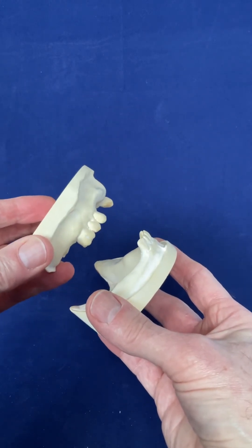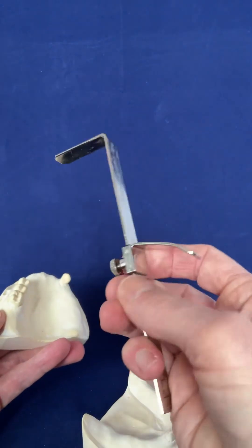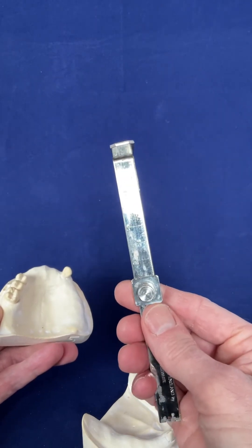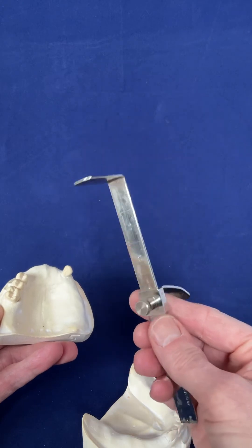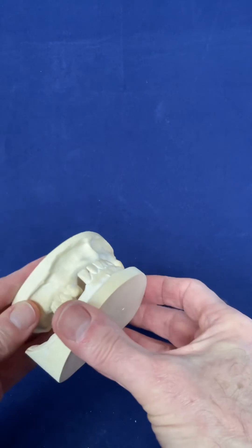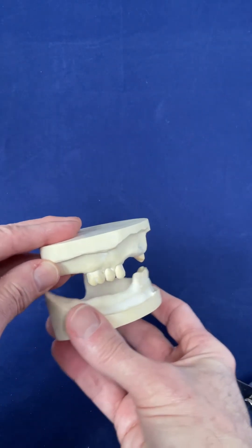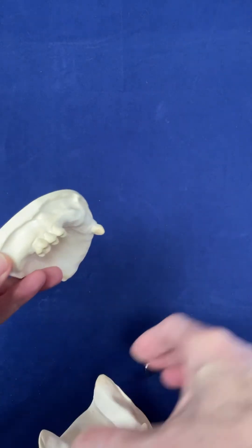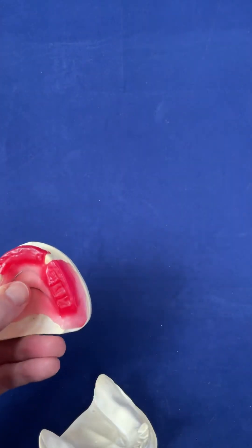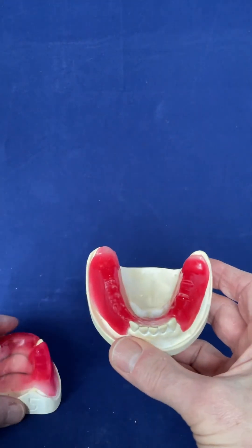When this patient attempts to occlude, there's no vertical stop — the patient can over-close, and there's no horizontal relationship or reproducibility whatsoever looking at tooth position. In this situation you have to record the vertical dimension. You'll need a Willis gauge or something similar; you measure the resting face height and subtract three or four millimeters to establish the occluding face height. With unopposed teeth, you also don't know the horizontal relationship of mandible to maxilla, so you need two occlusal rims again.